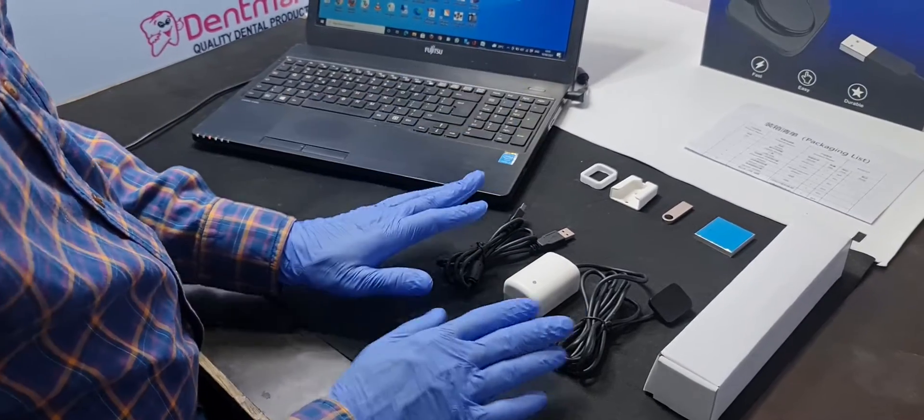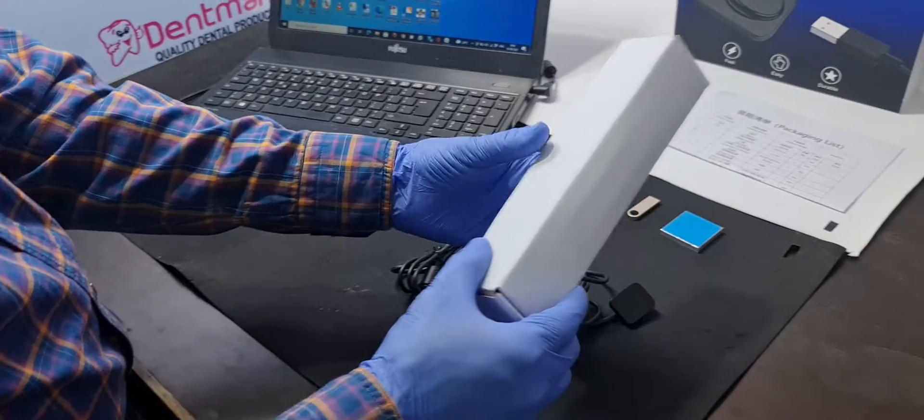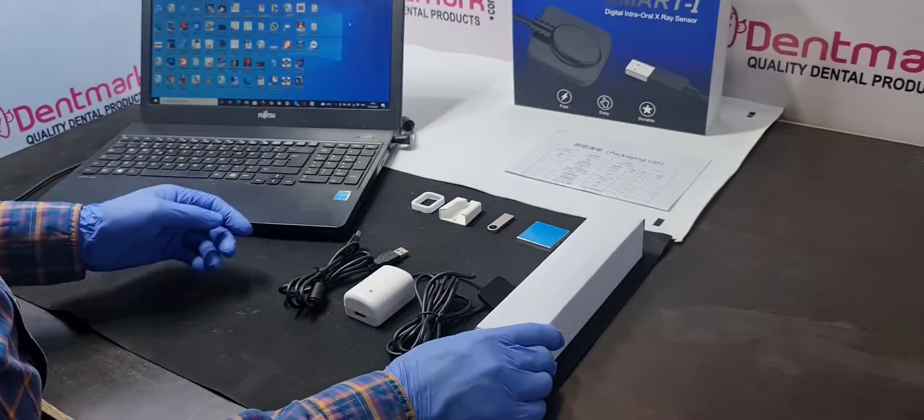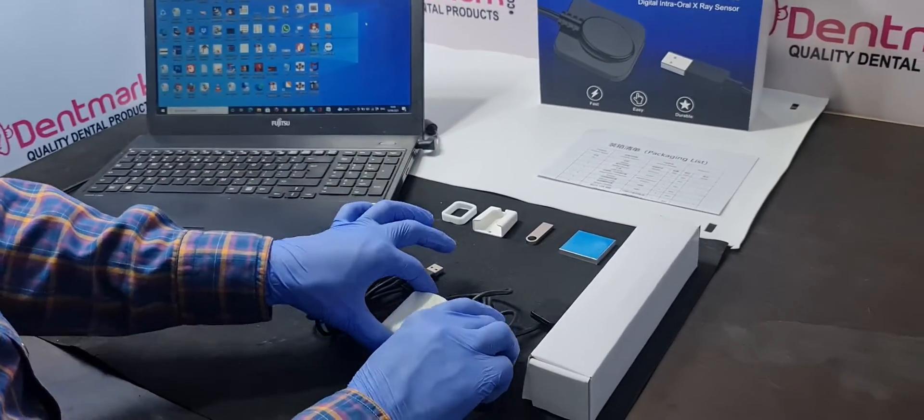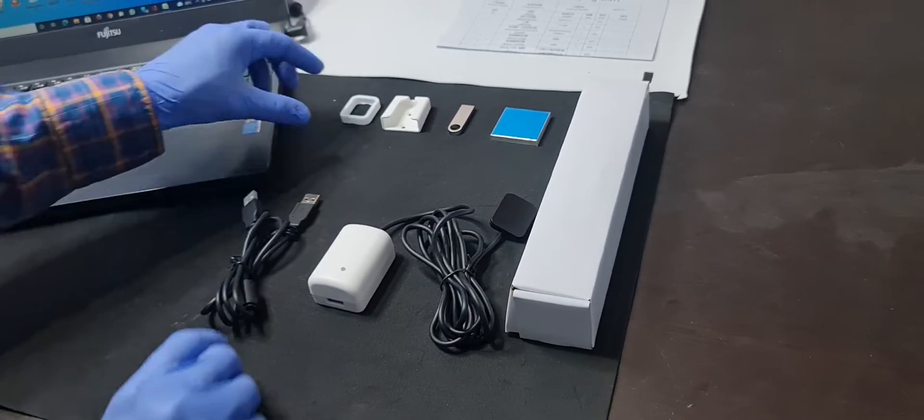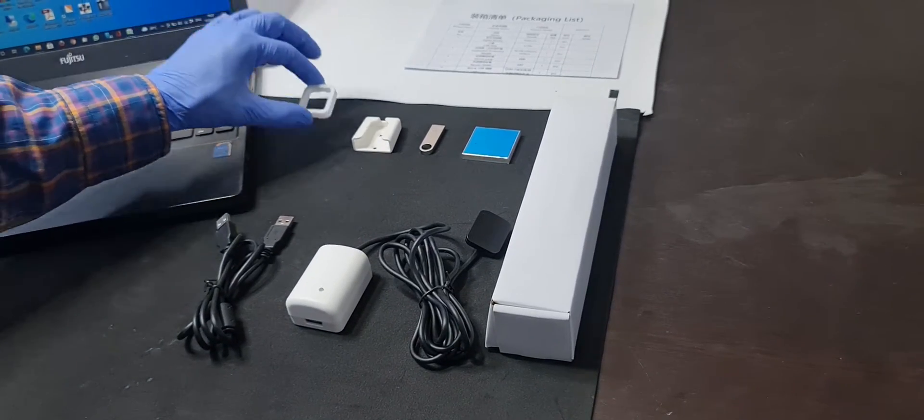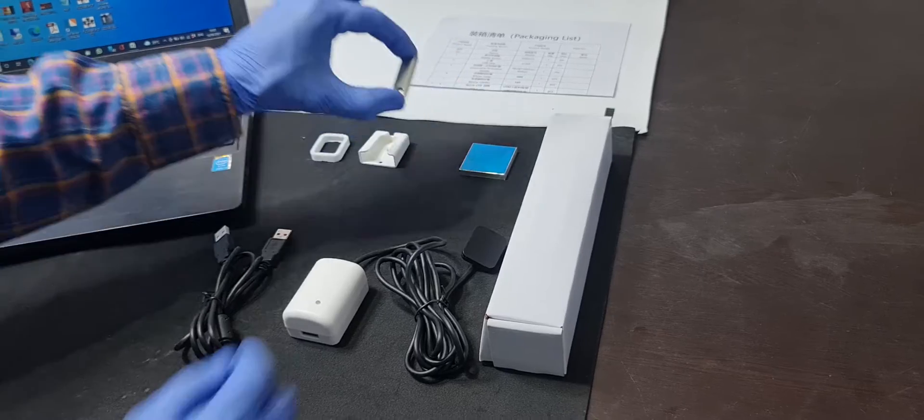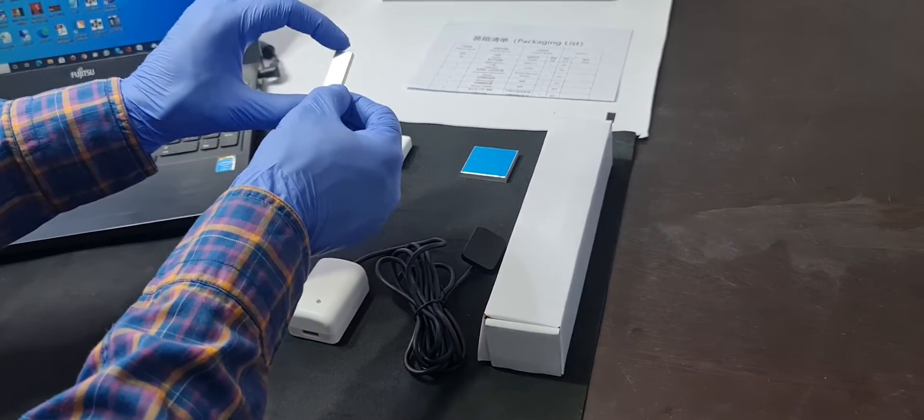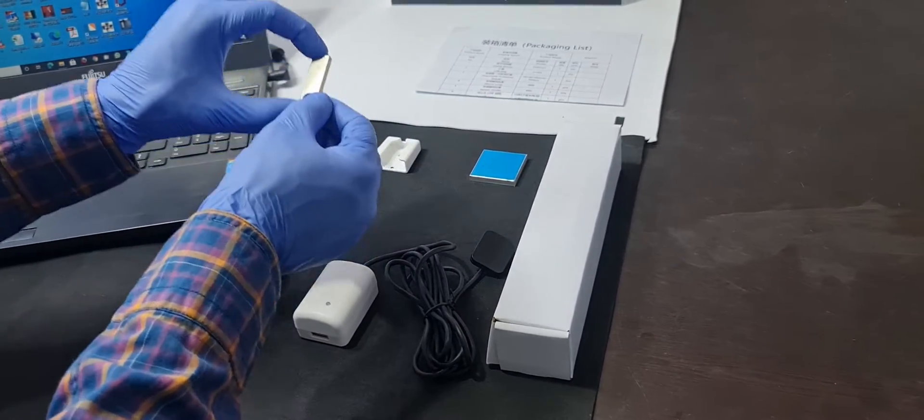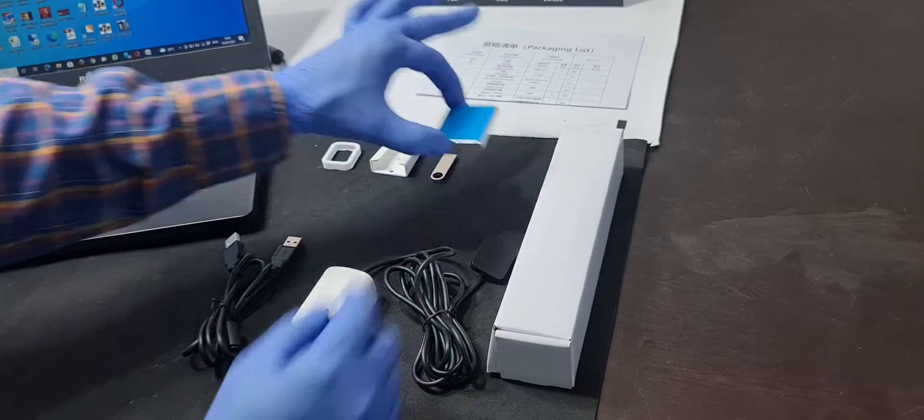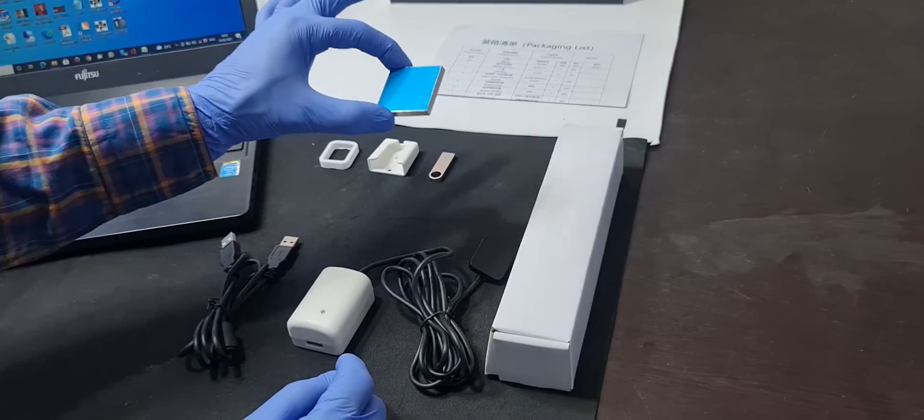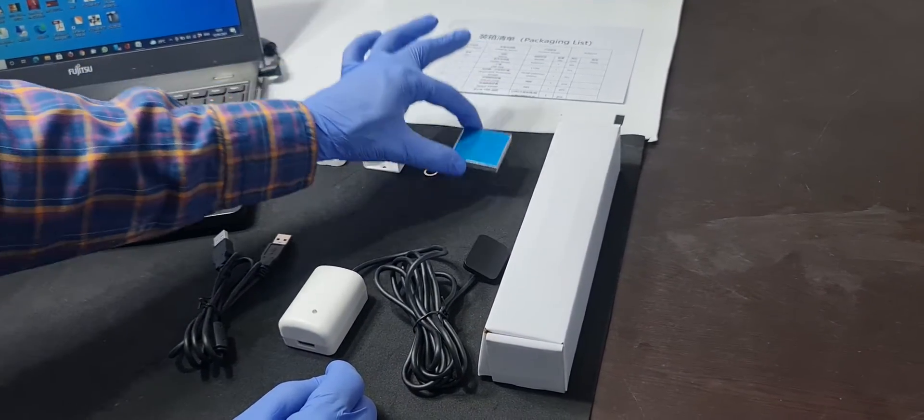In this packing, it will come with RVG sleeves, sensor, extension cable, protective sleeve, holder, USB disk. The software comes in USB disk and also the manual in the USB disk, and this is an aluminum plate for calibration. It will calibrate through X-ray.